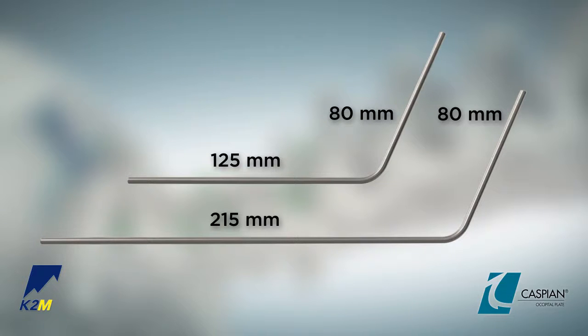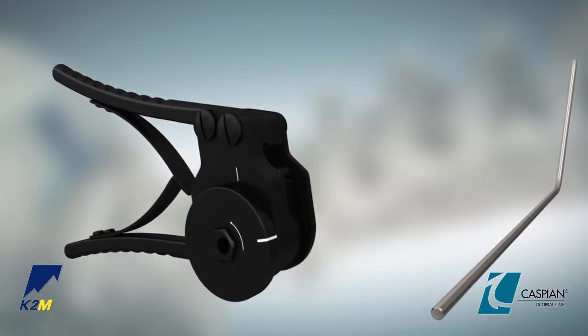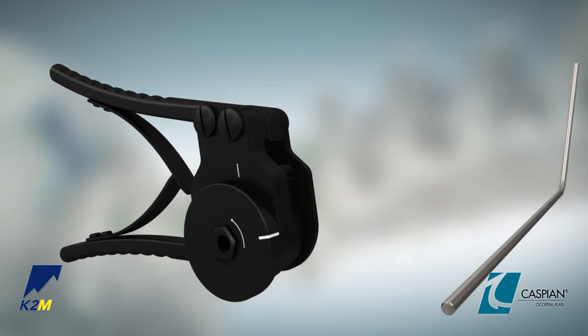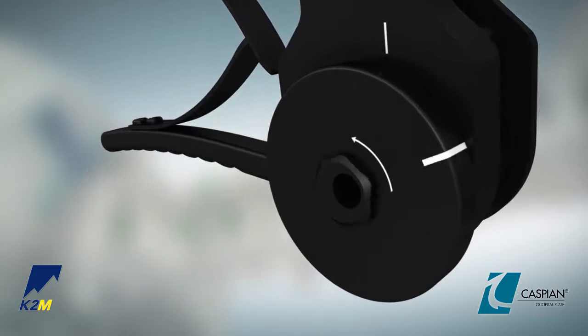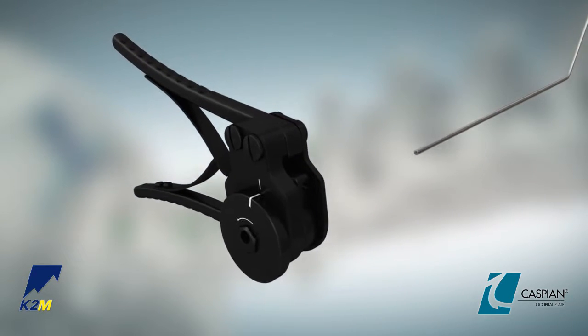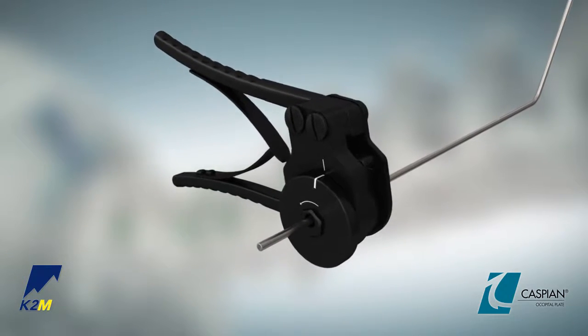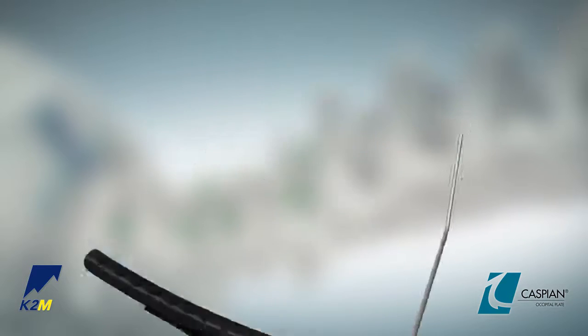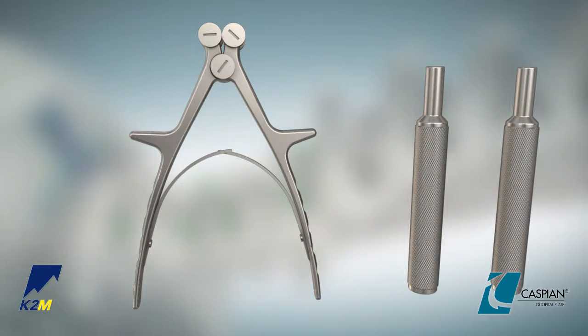130 degree pre-bent rods are available by request. Cut and further contour the selected rods if necessary so that they lie smoothly against the posterior surface of the occiput. To cut the rod, turn the wheel of the ratcheting rod cutter counterclockwise to align the two white lines. Insert the rod into the cutter until the determined cut spot is lined up with the cut line, then repeatedly squeeze the handle and release until the rod is cut. The rod bender or tube rod benders may be used to contour the rods to the desired amount of lordosis or kyphosis.